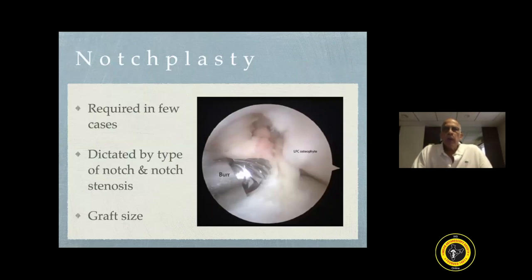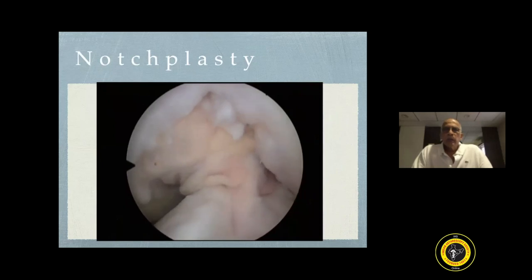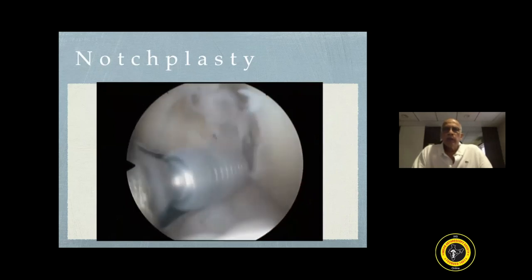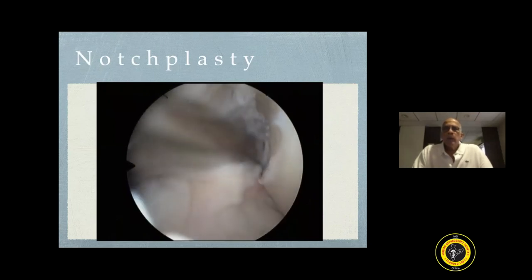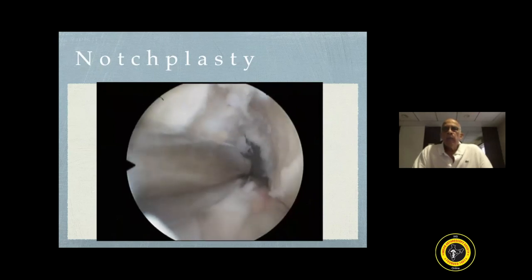Notchplasty is not required in all cases. It is dictated by the type of notch and whether the notch is stenotic, and should not be done routinely as a part of ACL reconstruction. This is a case where the notch is extremely stenotic — as you can see, there are osteophytes which are narrowing the notch. A burr and then a bone cutter have been used, and one can now see right up to the posterior margin of the intercondylar notch. It is only when you can see this area that you can select your femoral isometric point or the anatomic footprint of the ACL.